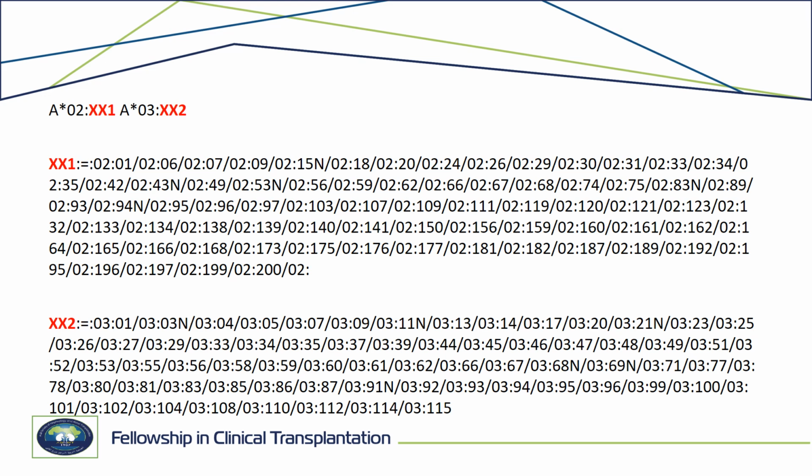So this means that the machine is able to identify the low resolution typing, which is 02 and 03, but cannot resolve the high resolution typing.